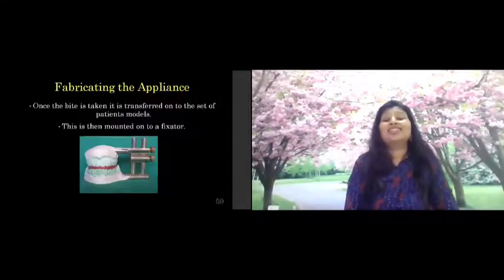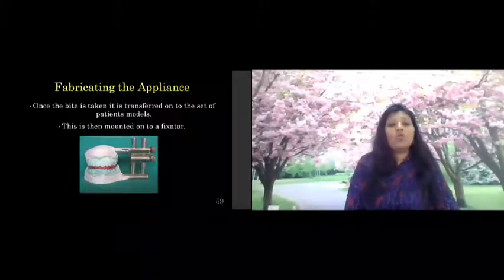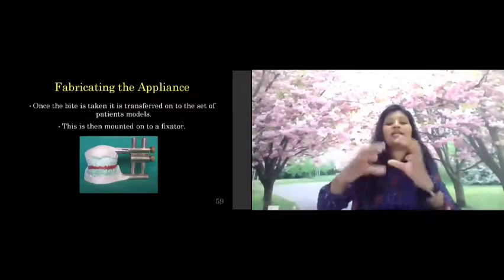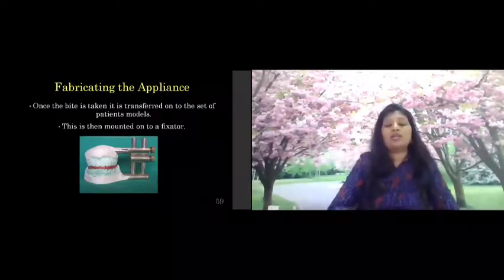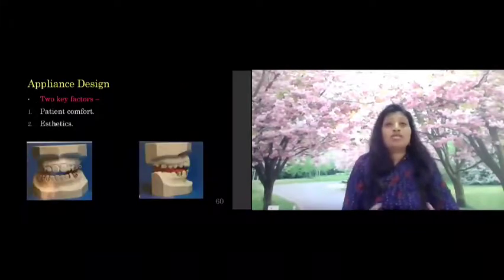And the next step is fabrication of the appliance. For that, what you do is you take the two models along with the wax bite and mount them on an articulator or a fixator. After you do that, you are supposed to design an appliance.